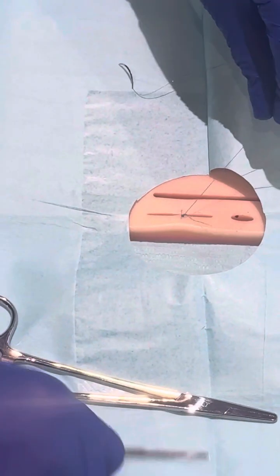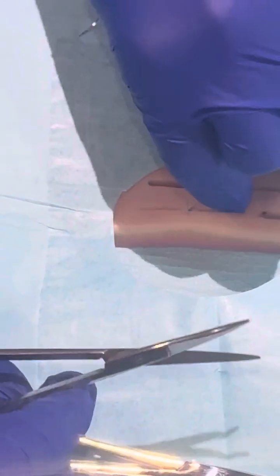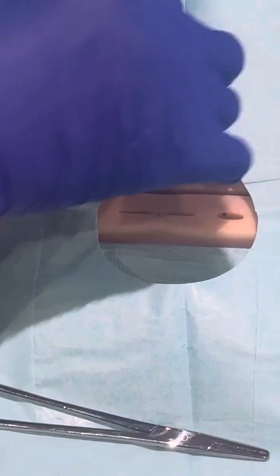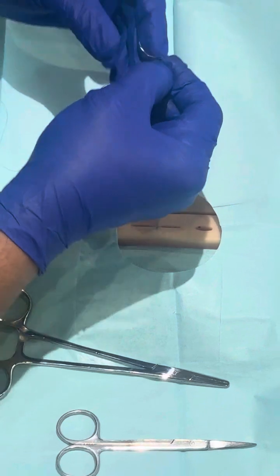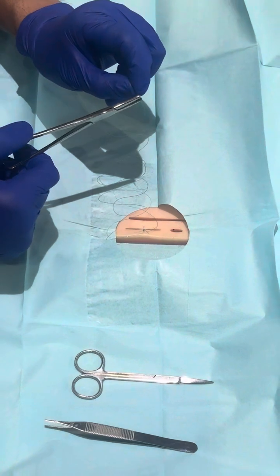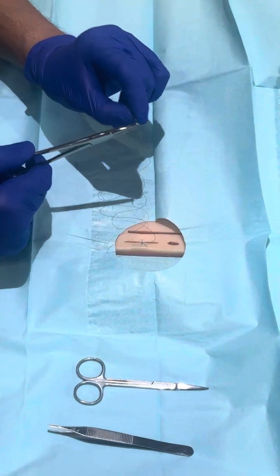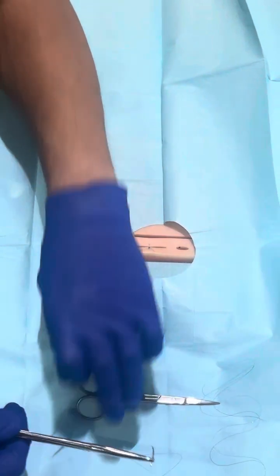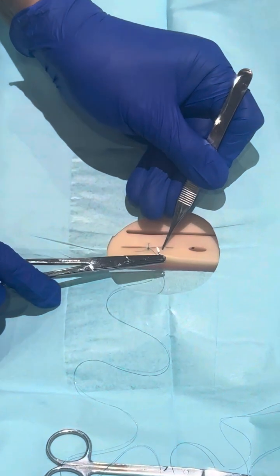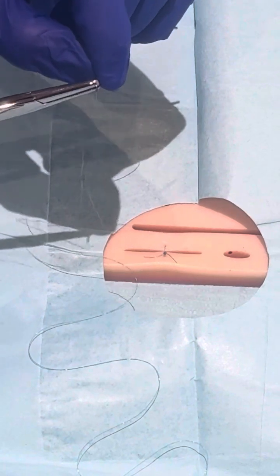When you cut this, cut at least 1 centimeter. Sometimes when you have an assistant, your assistant can cut it for you. But if you're doing it by yourself, you have to make sure that you cut it and do not run. As I've said, you always start at the middle. Now on the second suture, it doesn't matter wherever you start. It's either on the top or the bottom of the wound, as long as you can approximate it. So now let's start at the top of the wound.